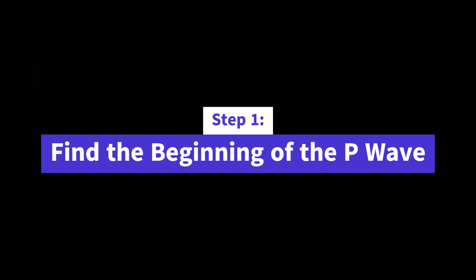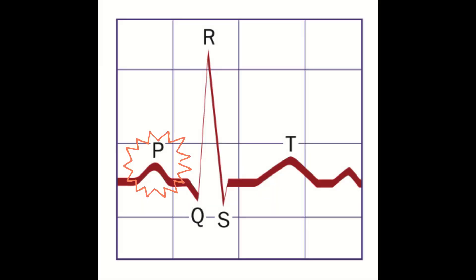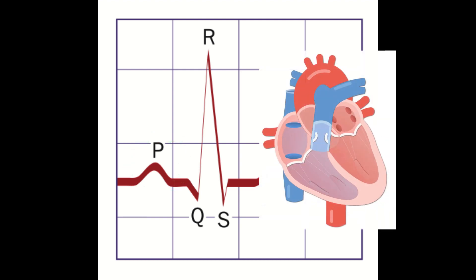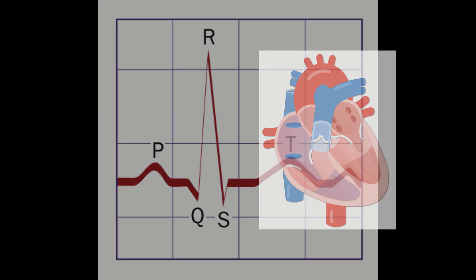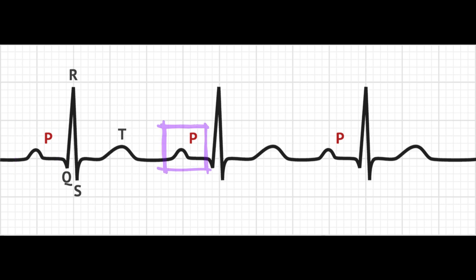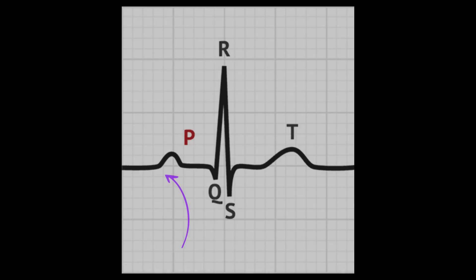Step 1: Find the beginning of the P wave. The P wave is the first wave in a normal EKG strip and it represents the electrical activity that causes the atria to contract. To identify the beginning of the P wave, look for the first upward deflection of the wave on the EKG strip.